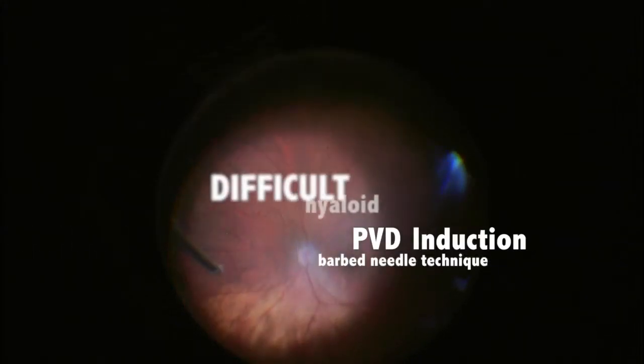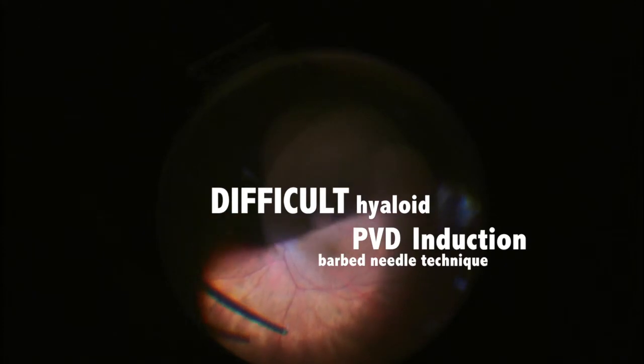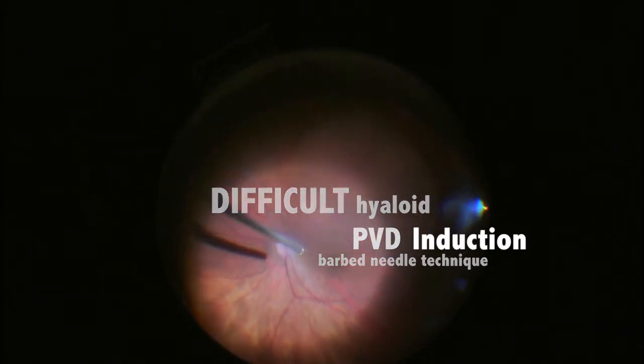PVD induction in the difficult hyaloid case, utilizing the barbed needle technique. This is a patient that had vitreo-macular traction.